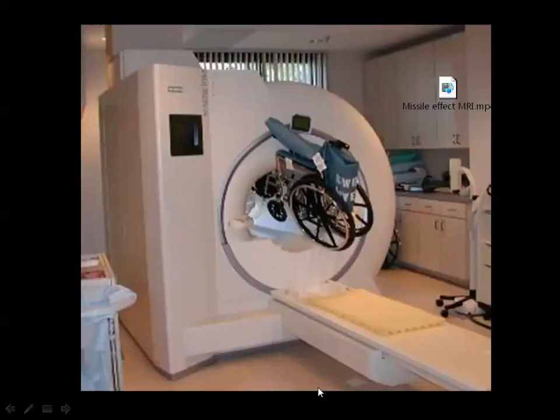Then you know that this is a very powerful magnet, and any metallic object that comes near to the MR magnet will be pulled in a very fast way, so that it may destroy some parts of the magnet.